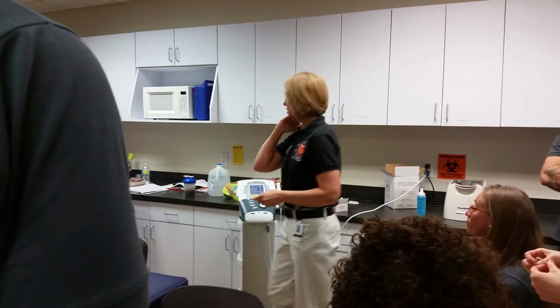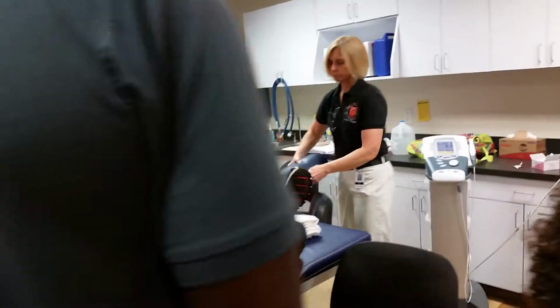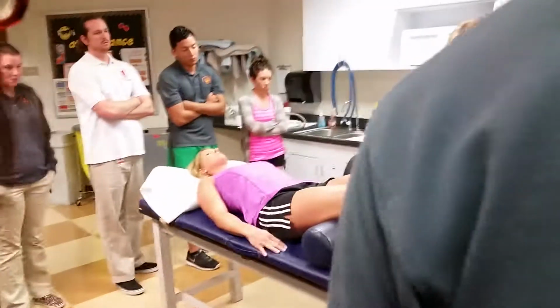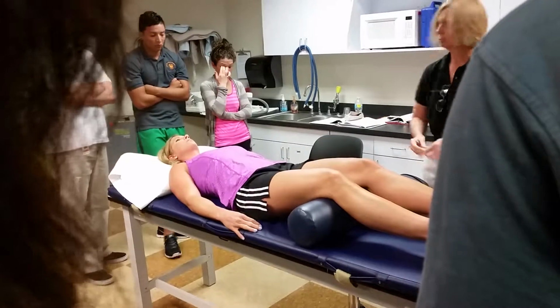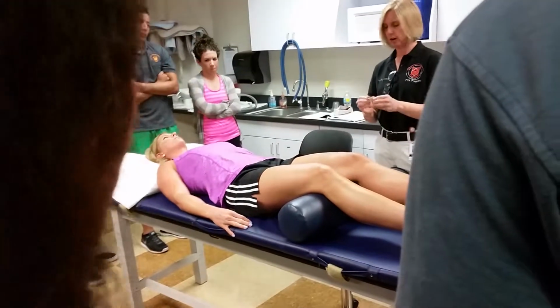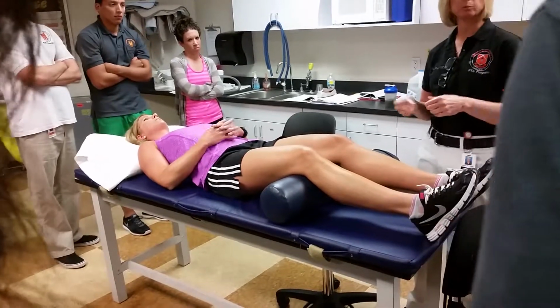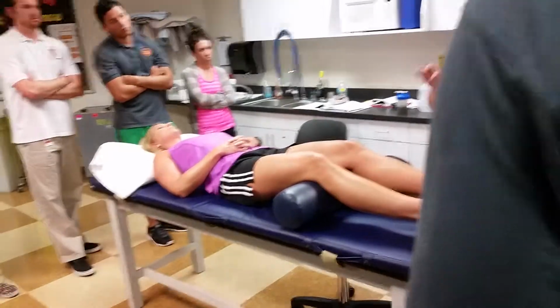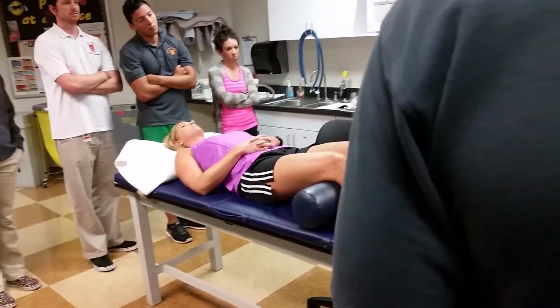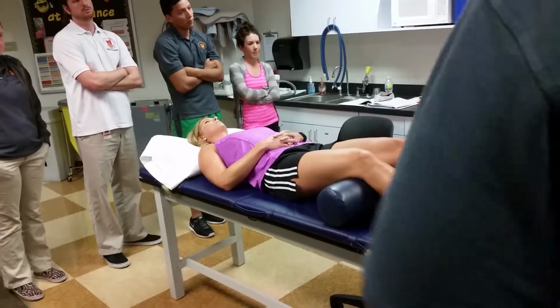In general, I'm going to have you lie down. Positioning, I would expect the same positioning that I would do for any other application. Person should be comfortable, because remember, you're going to be doing this for 8 minutes. So the way she was sitting when I first started, I've actually had students do ultrasounds in that position. But, well, that's remediation. Nobody's going to want to sit like that for 9 minutes.